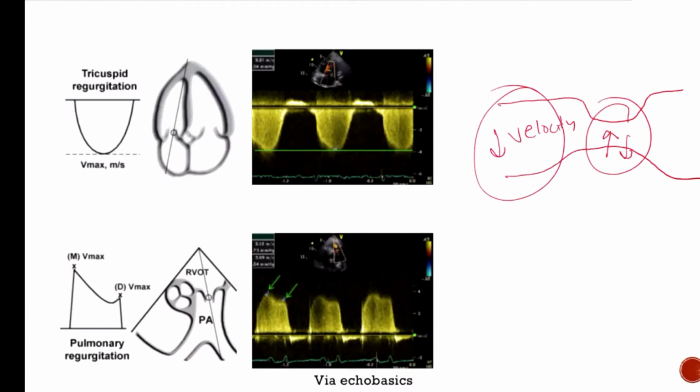Think about a hose. You have a hose that's on with water, and then you want to clean your car. So what do you do? You partially occlude the opening, right? And that allows that water to go out at a faster velocity. And that's how, using Doppler assessment, we're using the same principle of preserved energy through the changes in size of the orifice. So the equation that I want you guys to know is 4V squared, okay? And that's going to help you determine the differences in pressures across chambers, all right?